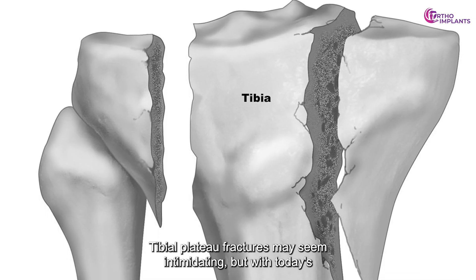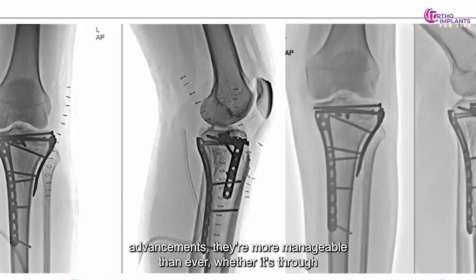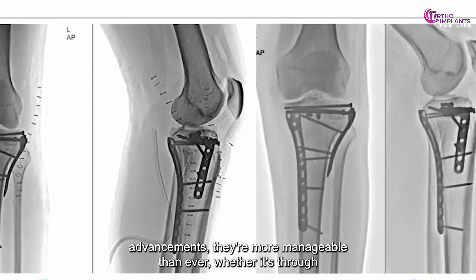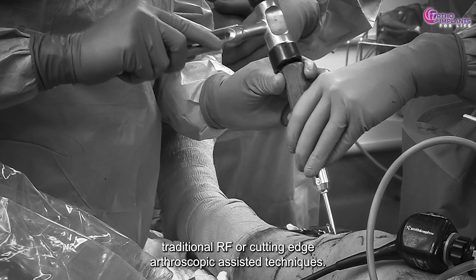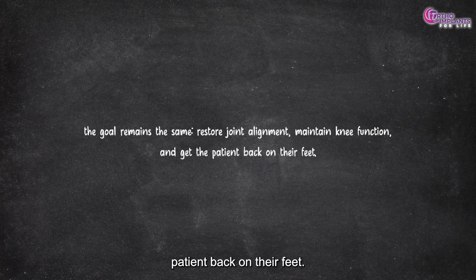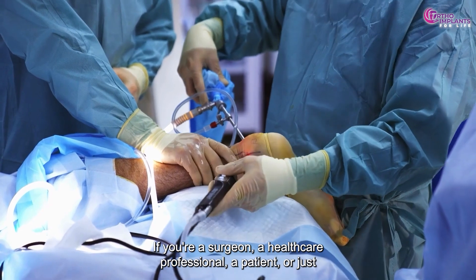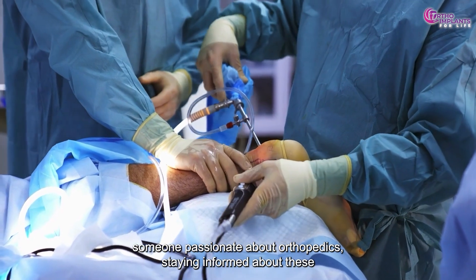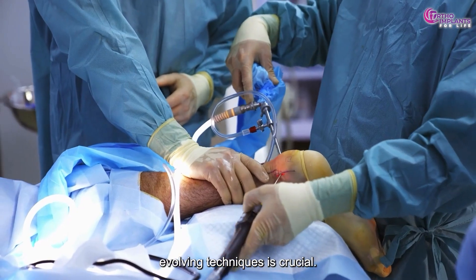Tibial plateau fractures may seem intimidating, but with today's advancements, they're more manageable than ever. Whether through traditional ORIF or cutting-edge arthroscopic-assisted techniques, the goal remains the same: restore joint alignment, maintain knee function, and get the patient back on their feet. Whether you're a surgeon, a healthcare professional, a patient, or just someone passionate about orthopedics, staying informed about these evolving techniques is crucial.